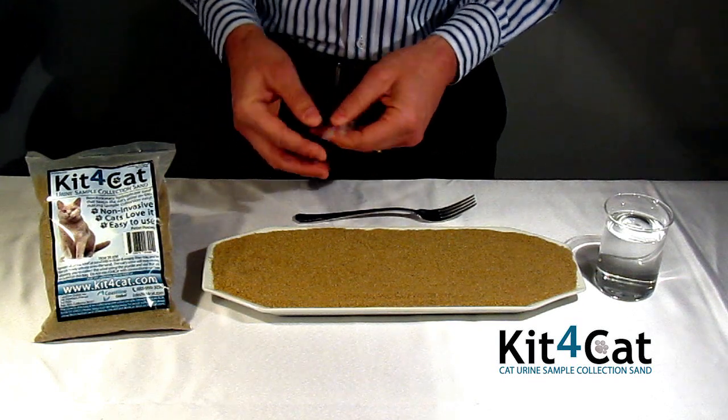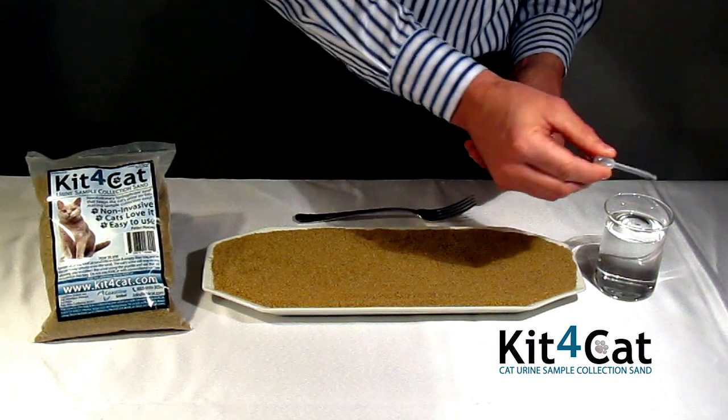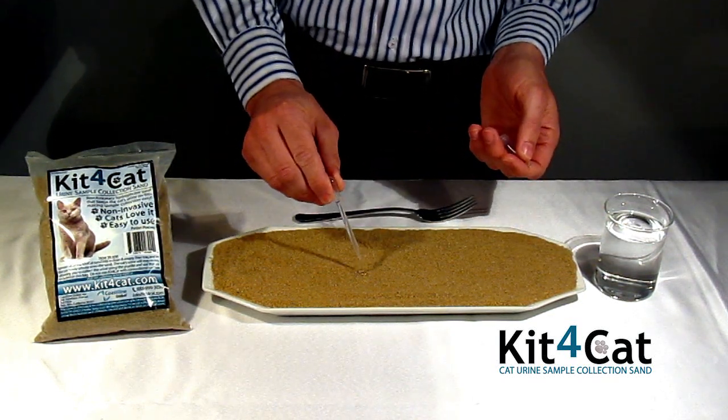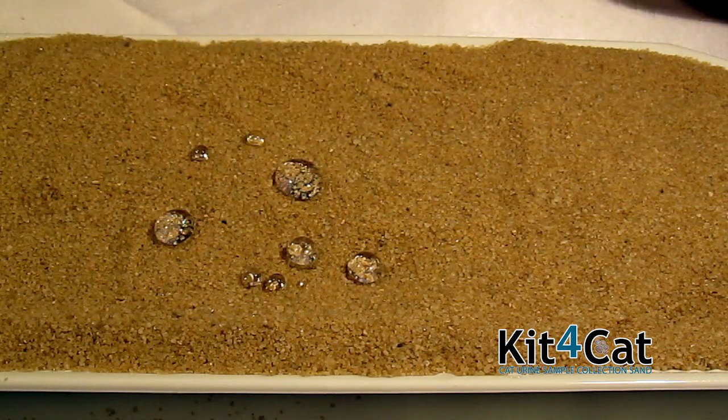Now we are going to show you how it is used. We are going to use the included pipette to demonstrate what happens when we collect water, which will simulate urine. As you can see, this remarkable sand does not allow liquid to penetrate in any way whatsoever.